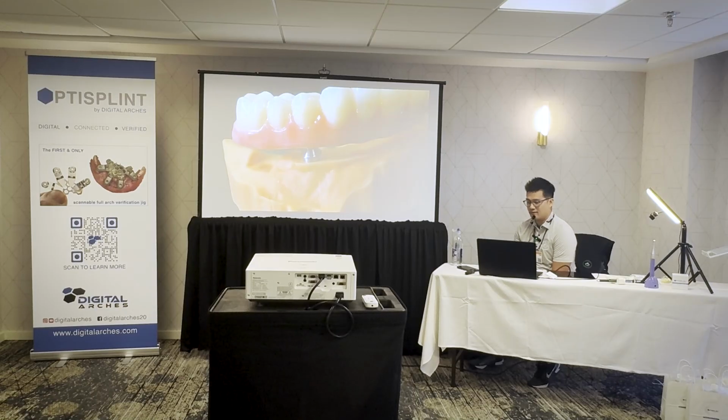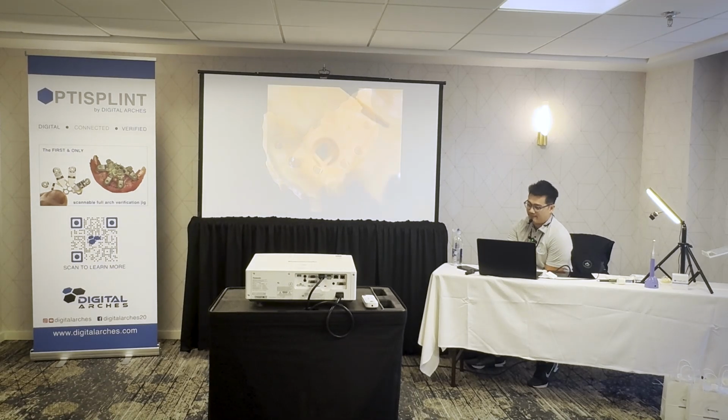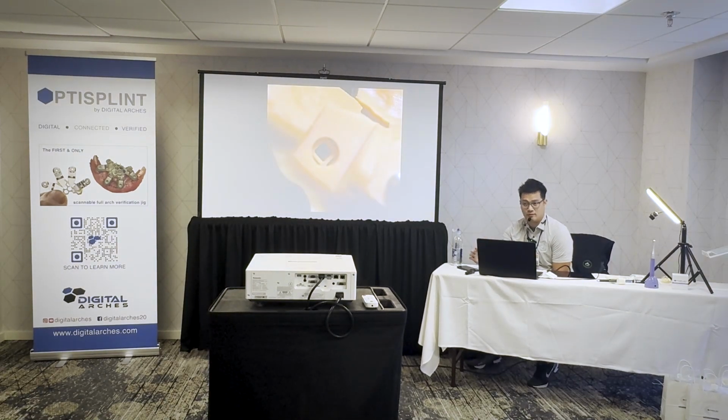And if you're doing this from ARCHTRACER or whatever, and I don't have a model, this is before OPTISPLINT, the question is: how accurate is my model? That's what I'm using to cement tie bases. If I give the same STL file of this model to everyone in this room, are these analogs going to fit the same? No, they're all going to fit differently. We have different programs, different printers, different resins. We post-process differently. Some of us never change our alcohol. All those things play a role in how the analog fits.